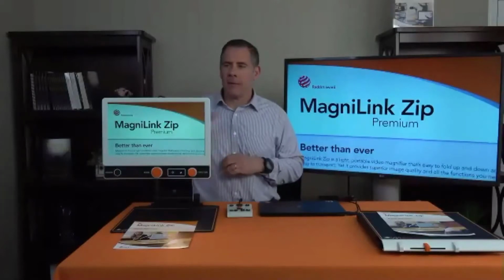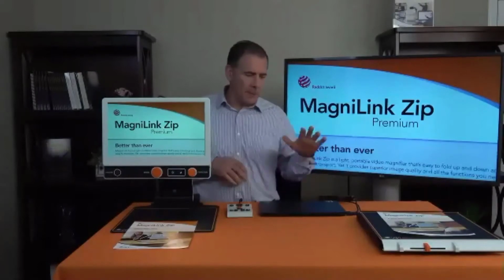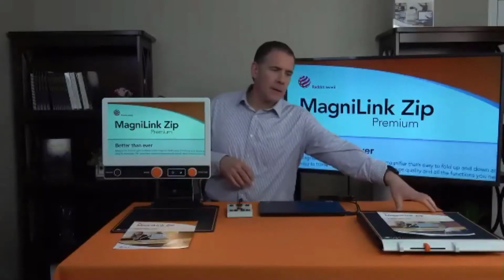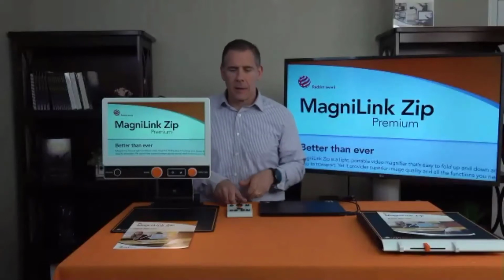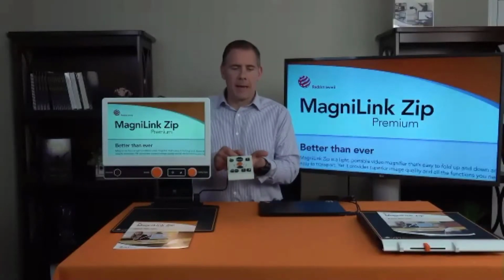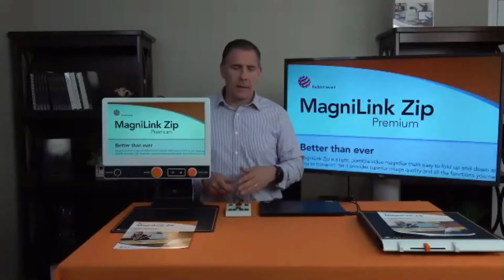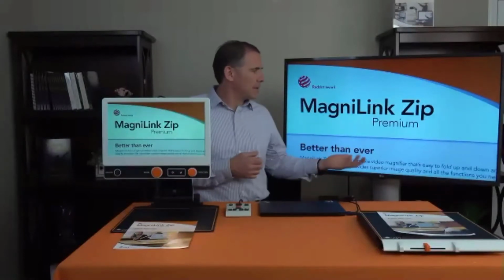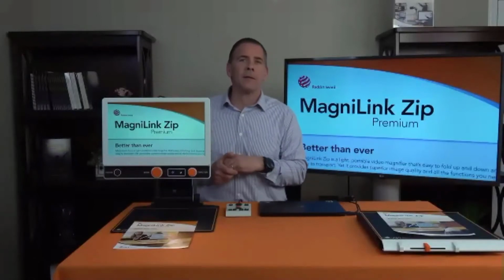On the table here, you see a zip. This is a 13-inch. I have a computer here, and I have an accessory XY table that can be added to a zip. I also have a little keypad, a large print, nice external keypad that you can run the zip with. And I have it all plugged into this nice big monitor next to me to help you see, so you don't just get the display on the 13-inch.